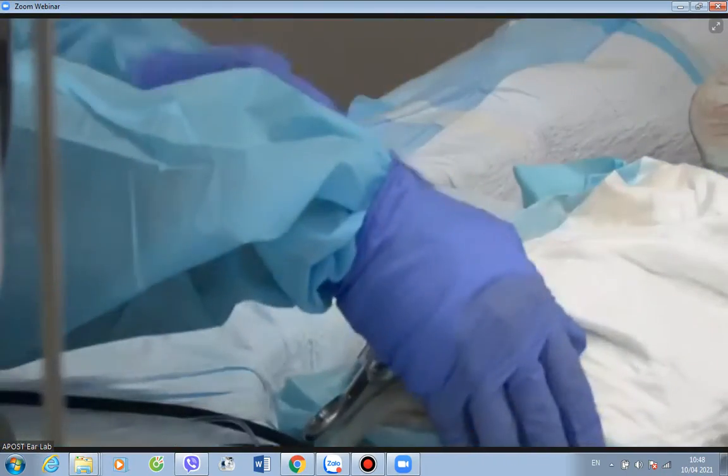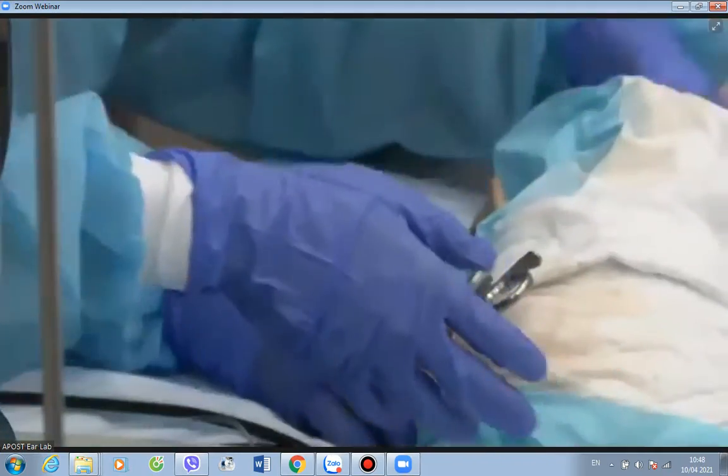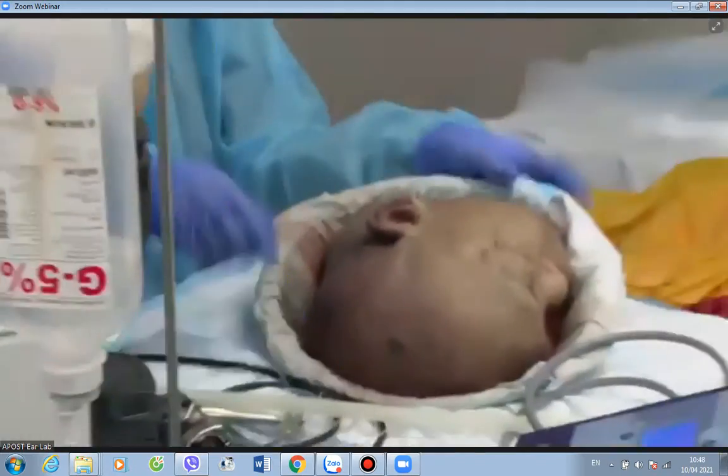So I don't think how much time that we have. Okay. So for the interest of time, we'll put it in context. I have prepared another specimen. In context.